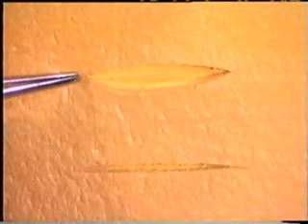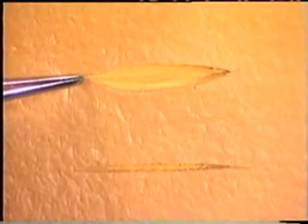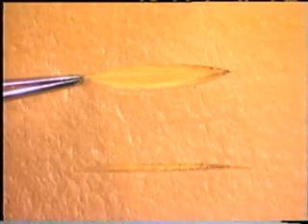There may be two types of wound you will be required to close. One, a linear wound, as you see here, the other, an elliptical wound. If you have to make an elliptical wound, try and ensure that the length of the ellipse is at least 3 times its width.